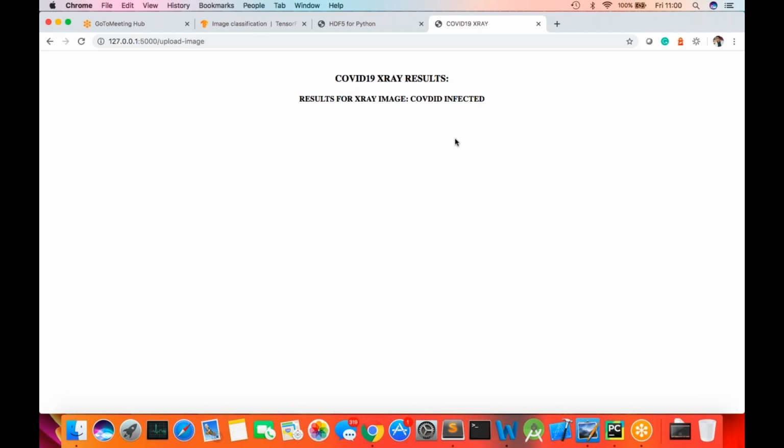But at the same time, right, this is not something which can be medically trusted, because the data set which we are using is Googled up here and there, right? So if we possibly try to work with the government, if we get the X-ray data sets, we can definitely try to do something better in the same problem statement.